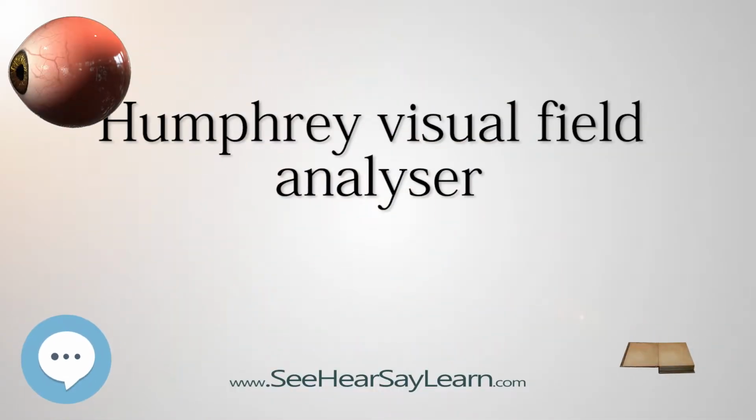Humphrey Field Analyzer, HFA, is a tool for measuring the human visual field. It is used by optometrists, orthoptists, and ophthalmologists, particularly for detecting monocular visual field. The results of the analyzer identify the type of vision defect.